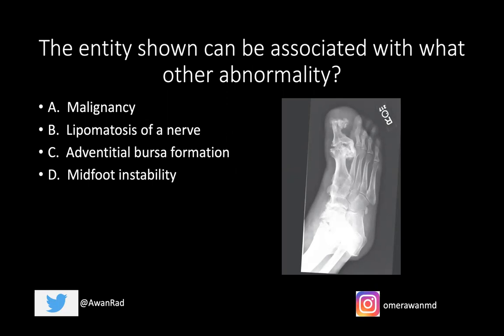What we have here is a frontal view of the right foot. Notice how disproportionately enlarged the great toe is when compared to the second, third, fourth, and fifth digits. Not only is there marked soft tissue enlargement of the great toe, the bone itself is actually enlarged. The entire first ray — from the level of the navicular, the cuneiforms, the first metatarsal, and the proximal phalanx — is markedly enlarged and irregular.